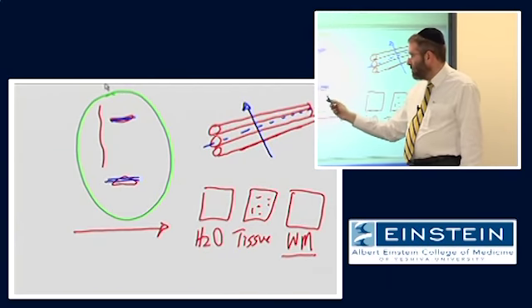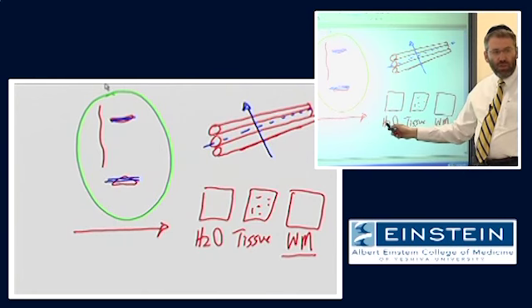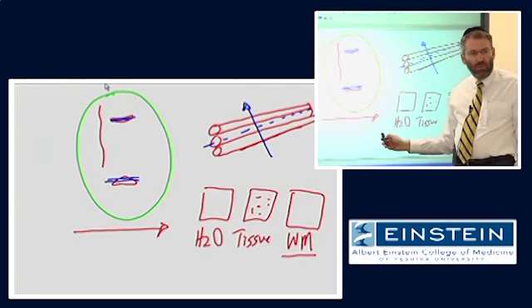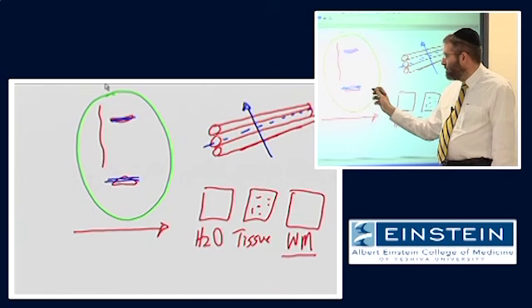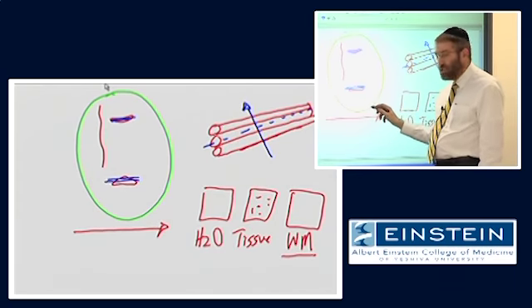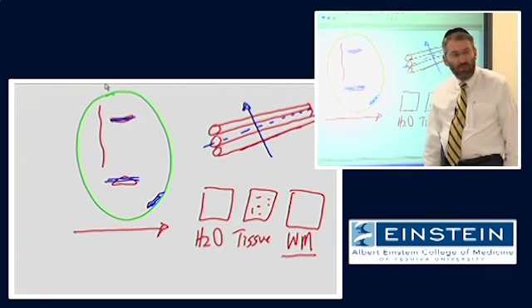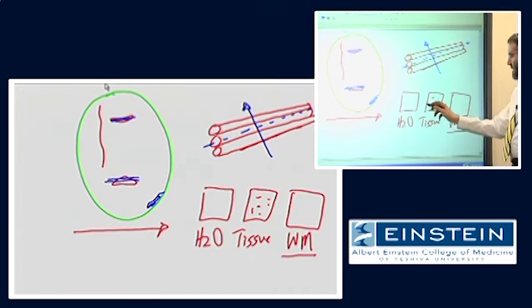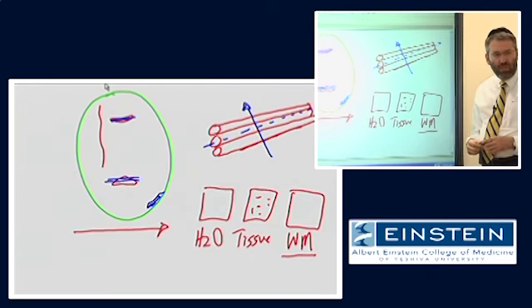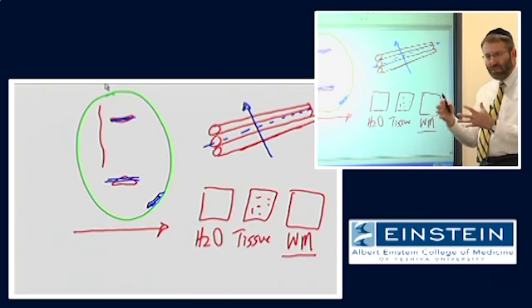So in this example, this is a brain region where there is a dramatic amount of diffusion moving left to right. In fact, the rate of diffusion left to right in the corpus callosum here is going to be much greater than the rate of diffusion, let's say, in gray matter in the cortex, which has a less systematically organized structure. And in gray matter, we have an inhibition or restriction of diffusion in pretty much all directions.